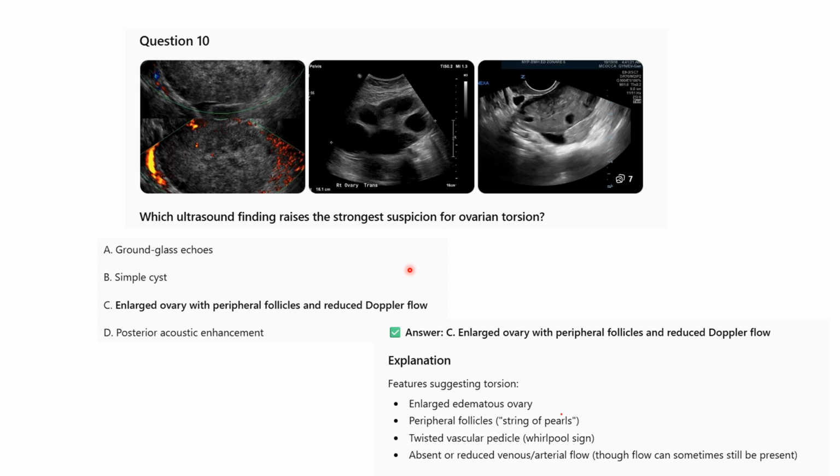So this brings us to the end of our daily quiz challenge on ovarian cysts. I hope you've mastered useful traits. Then I also expect that you should share the knowledge.